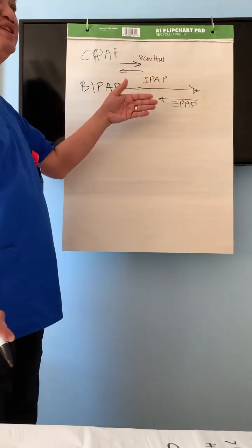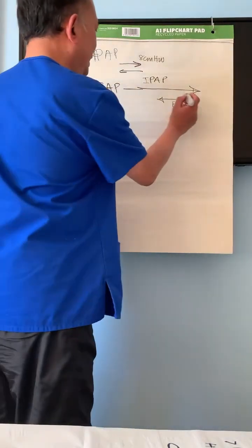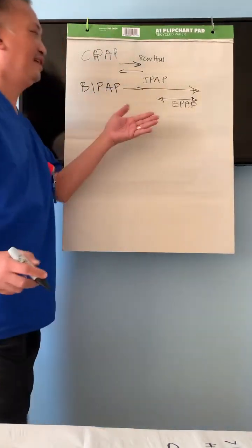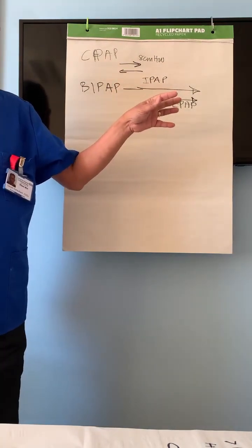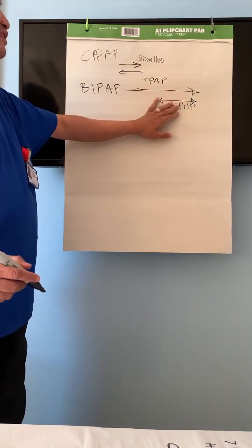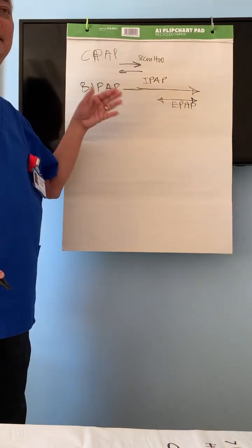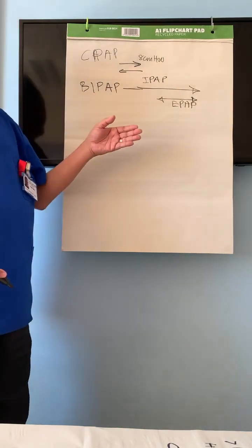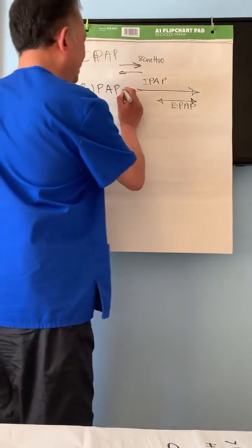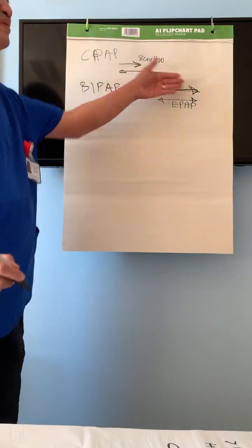Actually, this is the same thing as CPAP. At the time of expiration, it delivers a little pressure to prevent the airway from collapsing. This idea is the same as CPAP. A little less pressure at the time of expiration to prevent the total collapse of the airway, but giving a little more pressure at the time of inspiration because it's not suffocating alongside.